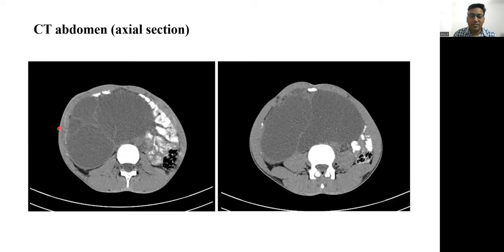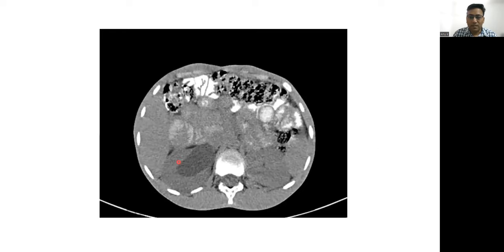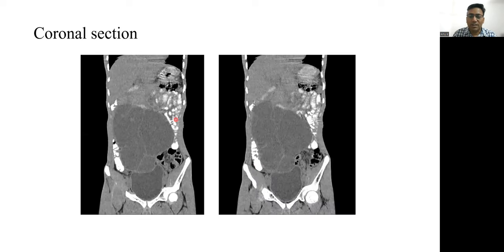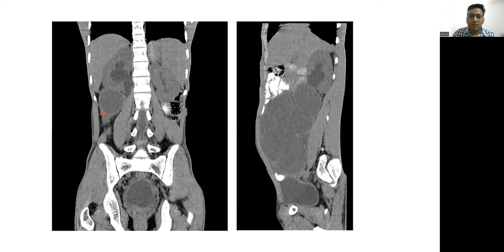This is the CT abdomen axial section. We can see a large cyst occupying the whole of the abdomen with thin septa. There is mass effect on the right proximal ureter causing hydronephrosis of the right kidney. This is the coronal section showing extension of the cyst from the right side of the diaphragm to the right side of the pelvis, with mass effect on the urinary bladder. The coronal and sagittal sections clearly show hydronephrosis of the right kidney due to the mass effect of this multicystic lesion.